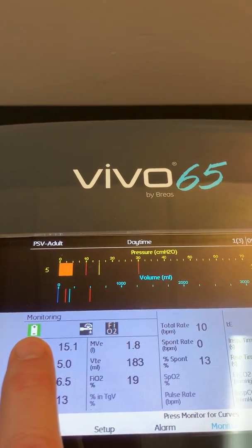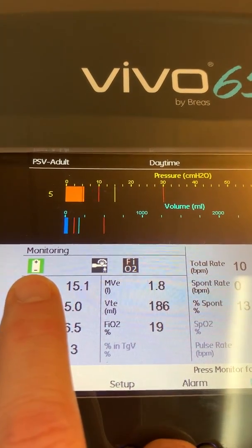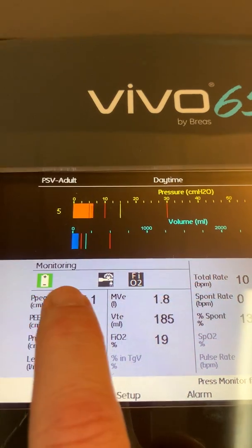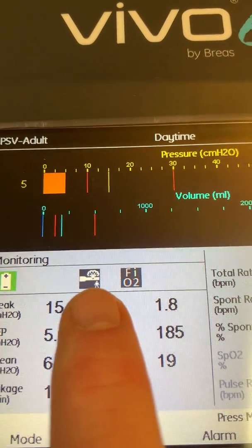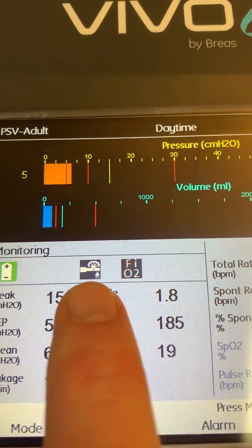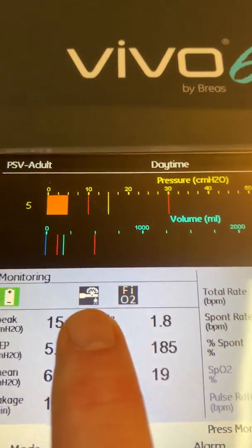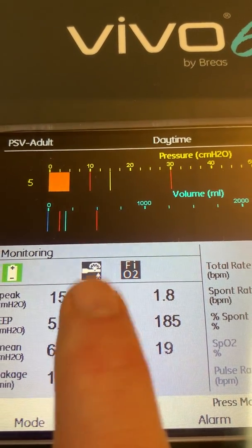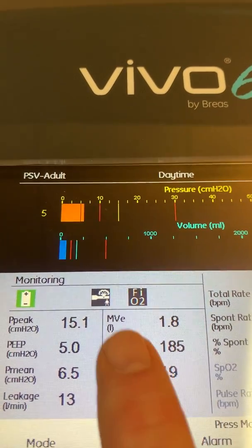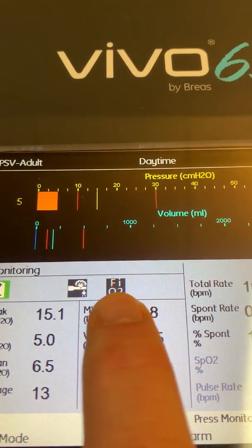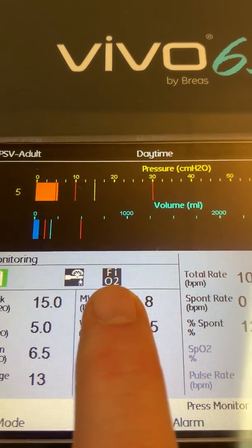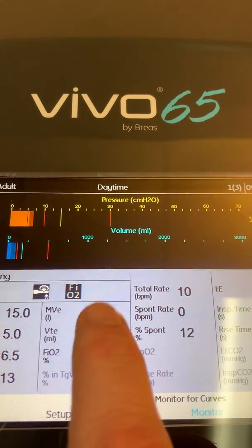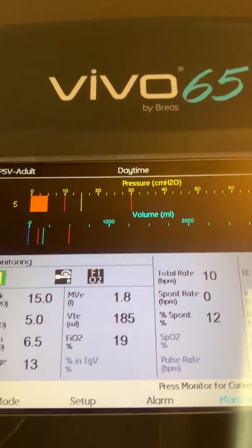In the main monitoring window, there's a value showing a full charge on the internal battery. If an external battery is attached, it would display its status. An icon indicates a passive circuit is attached to the patient — this icon would change for a single limb active circuit, dual limb circuit, or mouthpiece ventilation circuit. The FiO2 is connected to the device, and end tidal CO2 or SpO2 would also display in this section if attached.